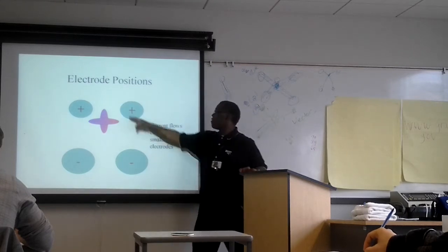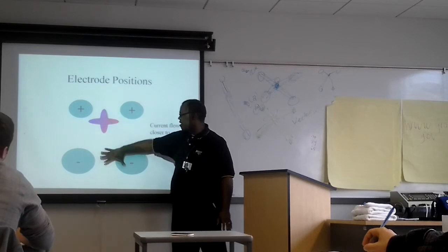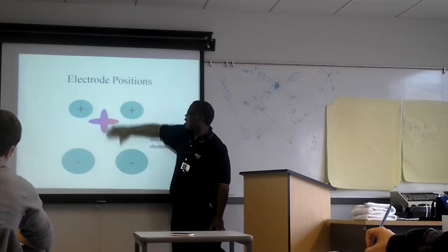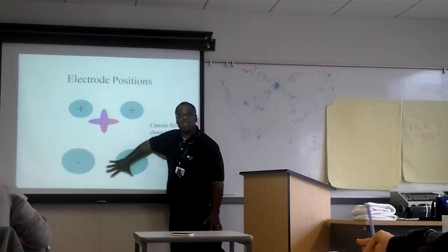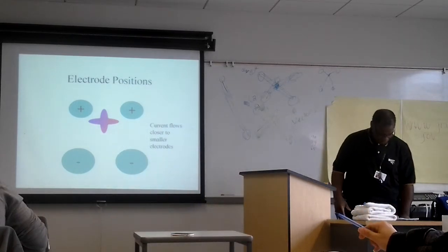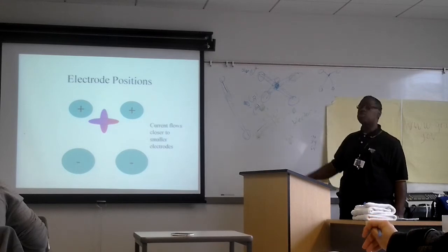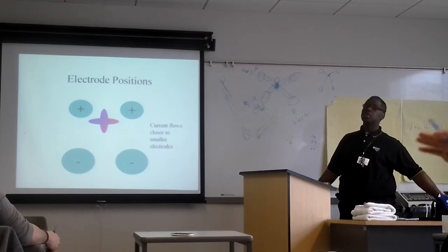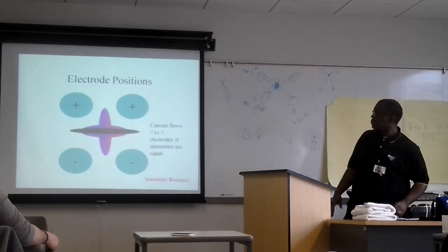No feeling. You're going to feel it right here. Okay? So it's getting closer to that. You know what I mean? So it's closer because it's a smaller, more active electrode. This one is dispersing more of the energy. Okay? So that's why. It can't be twice the size, but it can be a little bit bigger, so you still feel it. Now, once you move to twice the size, you lose your vector, basically. Okay.